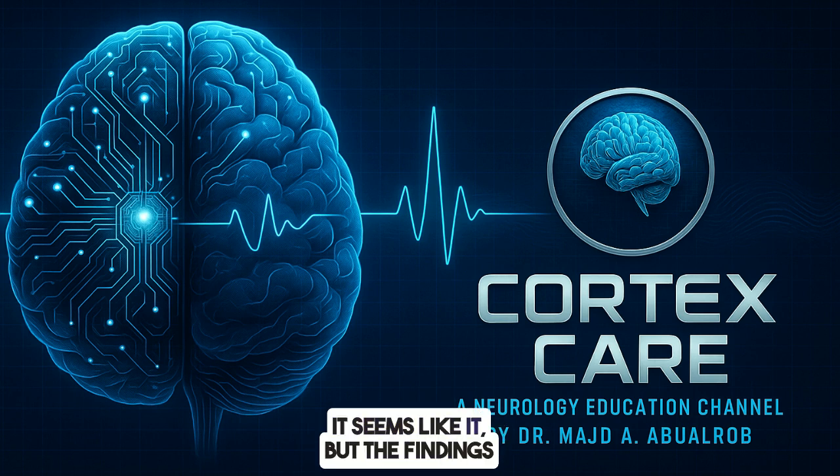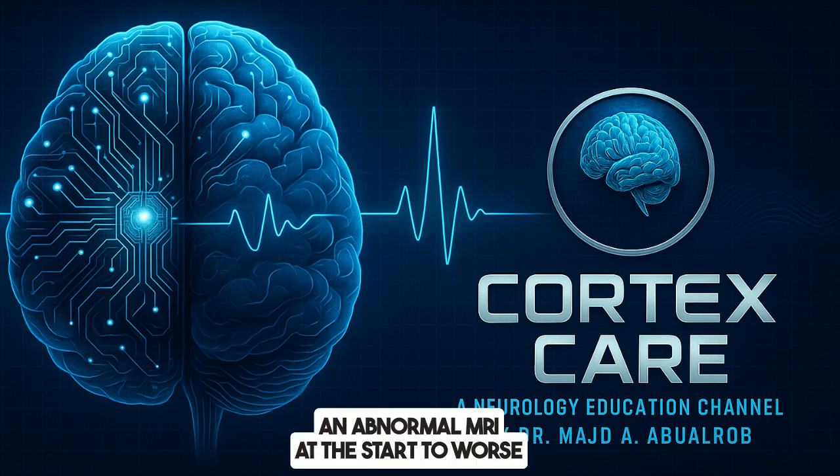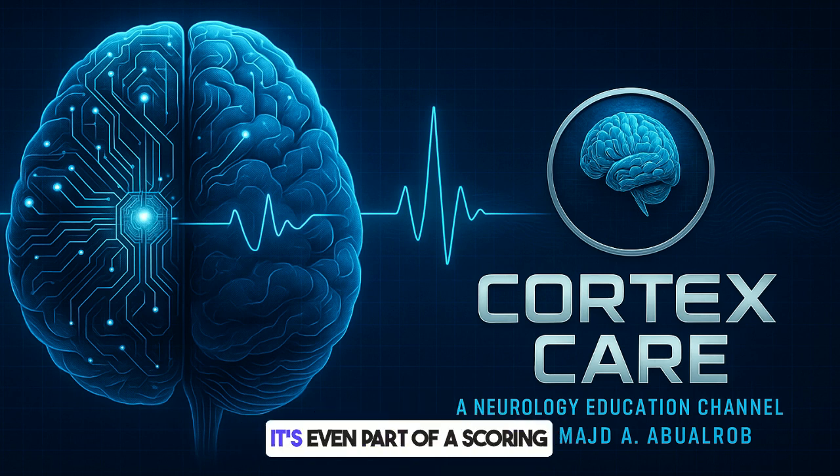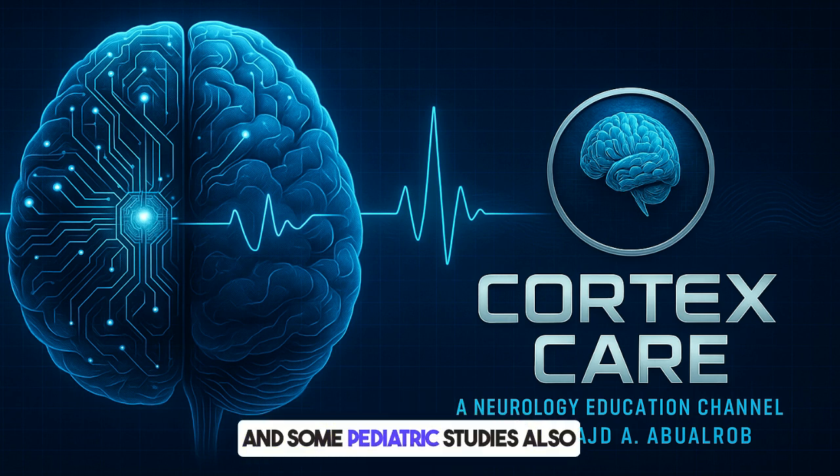It seems like it, but the findings have been a bit inconsistent across different studies. Right. The largest study did link an abnormal MRI at the start to worse functional status a year later. It's even part of a scoring system, the NEOS score, trying to predict outcomes. Okay, the NEOS score. Yeah, it includes initial MRI findings, and some pediatric studies also suggested an abnormal initial MRI meant poorer outcomes. But more recent data sort of nuances that.